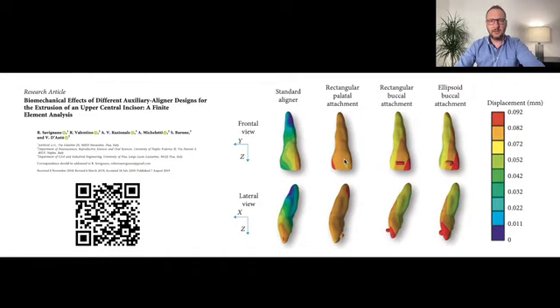And then very close to it, but a little less in the lingual side. So it works. We have more cases, more and more, mostly for the upper anteriors, because placing an attachment big like this in the upper incisors is hard for the patient. Sometimes they don't like it, and sometimes, no, all times they don't like it. And we can try to help them, depending on the situation, depending on the movements, to place it in the lingual side. Mostly when we have them for retention, we can bond there.